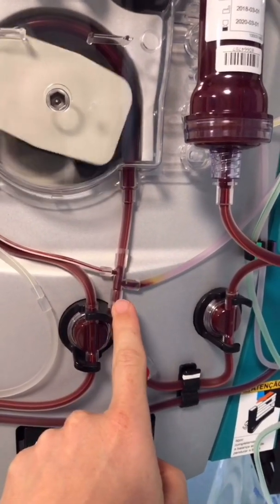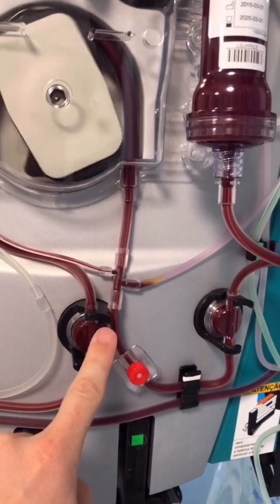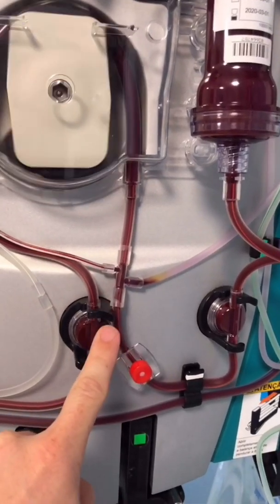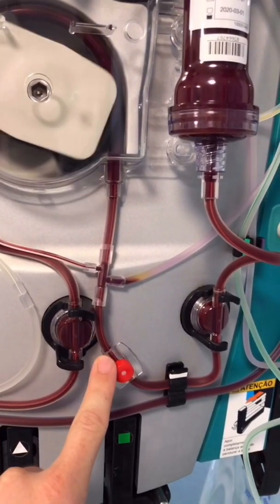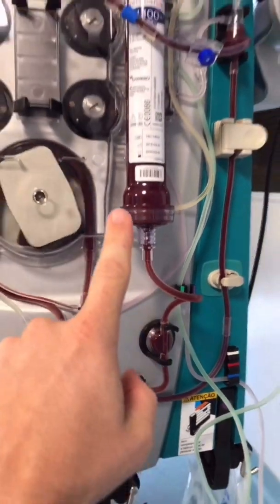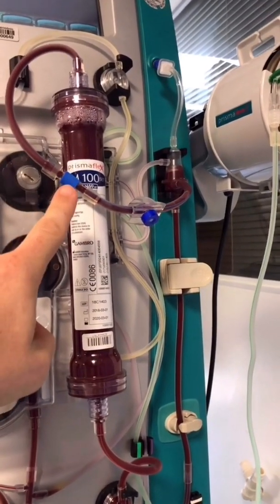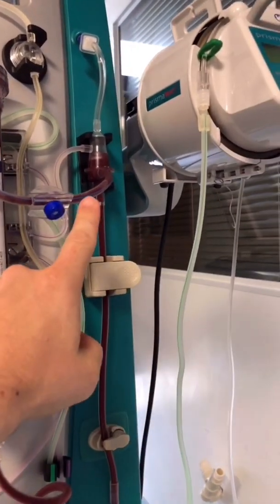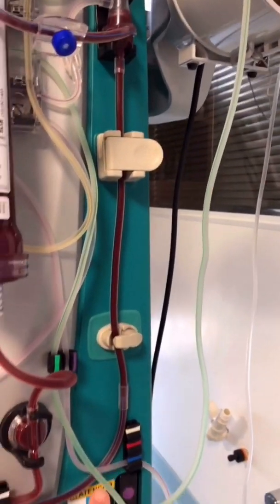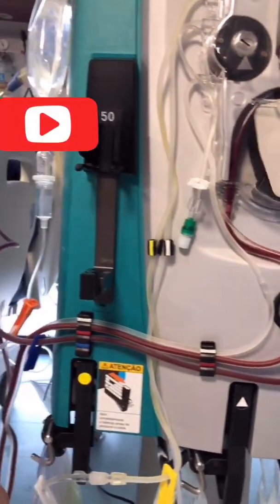This is where heparin enters the circuit if you are using it, and here is where your pre-filter replacement solution enters when you are using pre-filter replacement. Then the blood goes up through the pressure port into the filter, turns around, and is now considered venous blood, going into the air chamber.